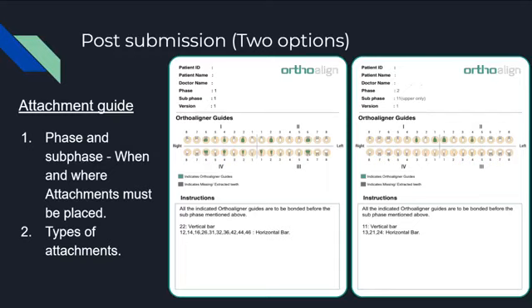Okay, so I think we got one more last question over here. How effective compared to traditional bracket? So what we can say is aligner therapy is just as effective as traditional brackets. However, it does come with a lot of responsibility for the patient, a very high patient compliance as well. If the patient does not wear their aligners for 22 to 23 hours a day, then of course aligner therapy is not going to be effective. It's not that the aligner is not effective, it's because of the external factors that the aligners are not worn for a long enough time.